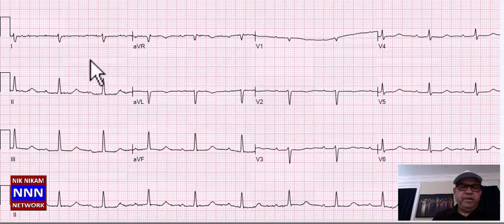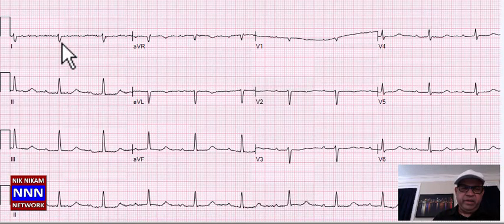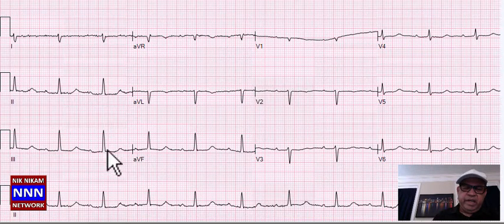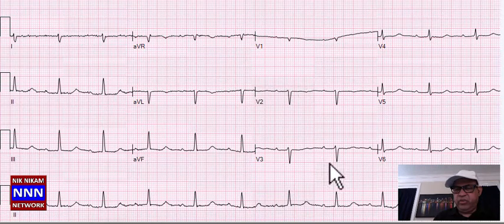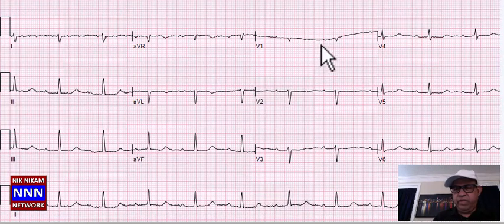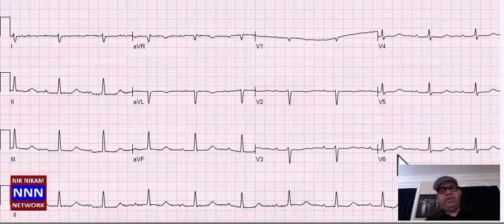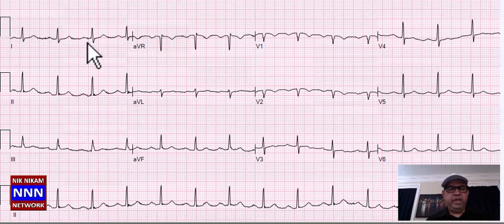Here we have right axis deviation because lead 1 is negative — unless leads were misplaced between right and left arm. The inferior leads have ST-T changes. Anteriorly, loss of R-waves suggests possible anteroseptal myocardial infarction. Laterally we have ST-T changes. This is an abnormal electrocardiogram.